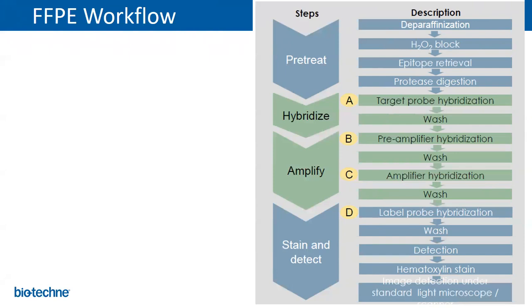RNAscope probes are sampling your RNA target in these little bite-sized chunks in 50 base pair pieces. So even if you have some RNA degradation or fragmentation, we should still be able to pick up the signal. So it's crazy, but yeah, in the workshop today, we're not going to be doing RNase-free conditions. Again, it doesn't hurt. And if I have a sample type I come across where someone's not getting signal, that's one thing I might recommend: especially in your sample prep portion, like when you're collecting your tissue, use RNase-free water. Be a little bit more careful. Wear gloves, but it's not necessary.